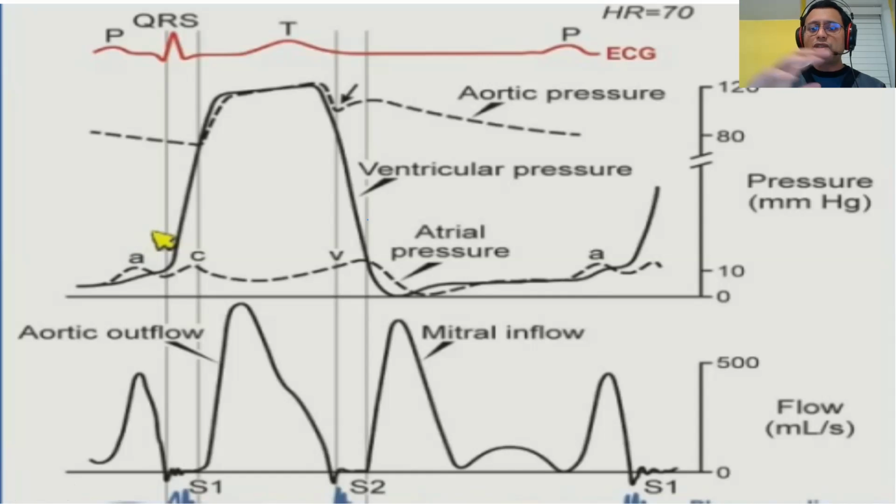All right. So let's recap. This is a line of someone with a normal diastolic function, normal LA pressure, normal IVRT, and normal deceleration time. As you get impaired relaxation, which is grade 1 diastolic dysfunction, the rate of slowing of the left ventricular pressure decline becomes slower, the IVRT goes up more than 100 milliseconds, and the deceleration time goes up more than 240 milliseconds, yet the LA pressure remains normal.